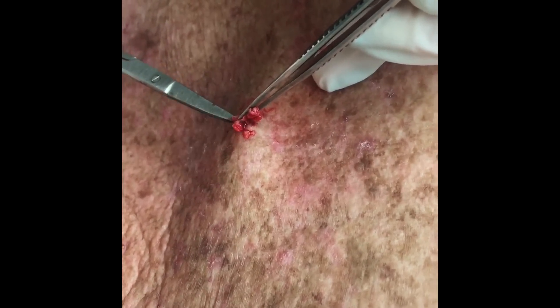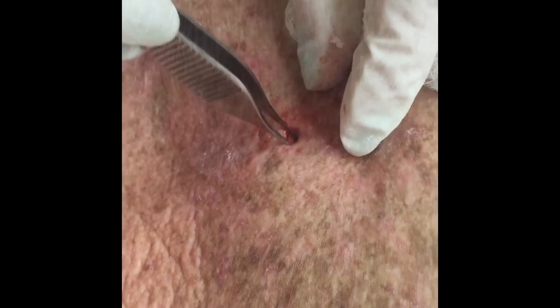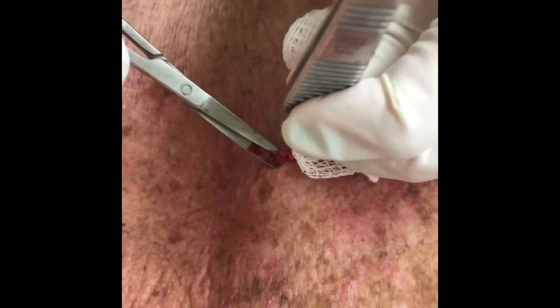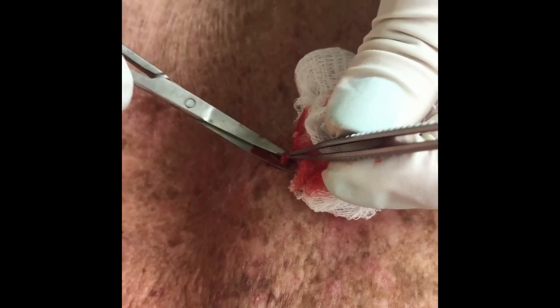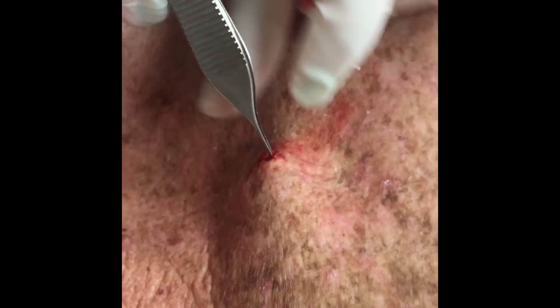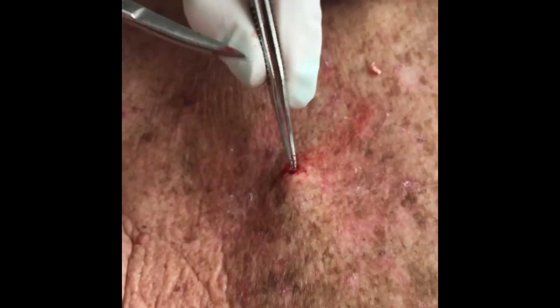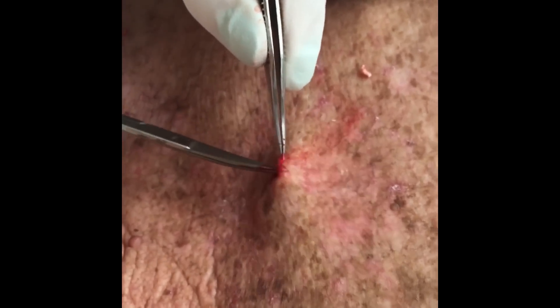These are a different kind of pickup that we have here — it has a couple of teeth. What causes those things? It's like your skin turns into itself and creates a little sack under the skin.